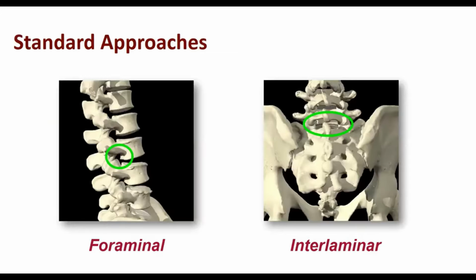As we know, we have two different approaches, the foraminal and the interlaminar approach, and here I would like to underline it. I don't want to call it a transforaminal approach because, with trans, every time we don't pass through the foramen. That's why I call it the foraminal approach. And as you know, we have different foraminal approaches like transforaminal, intraforaminal, or extraforaminal approaches.